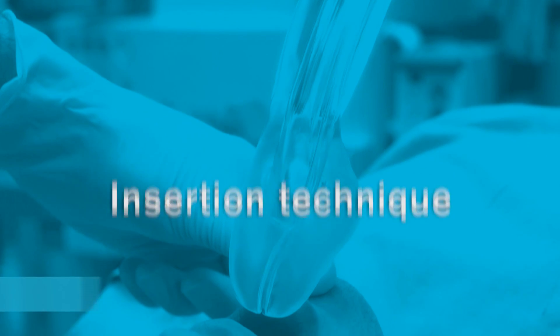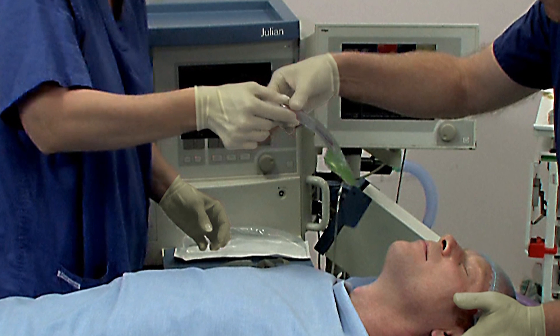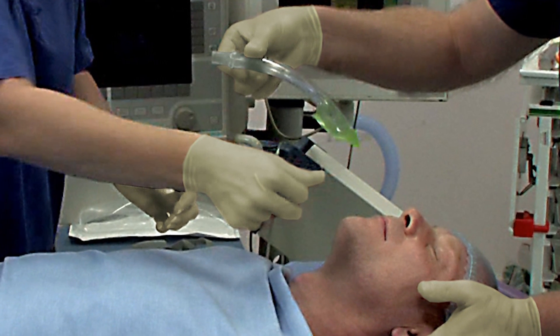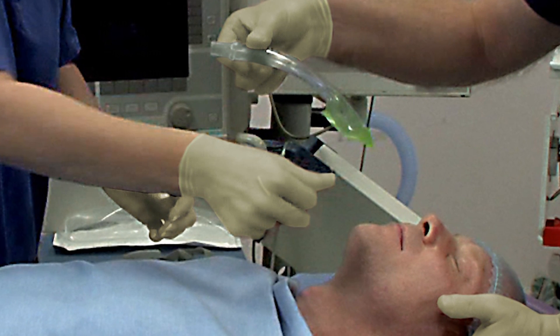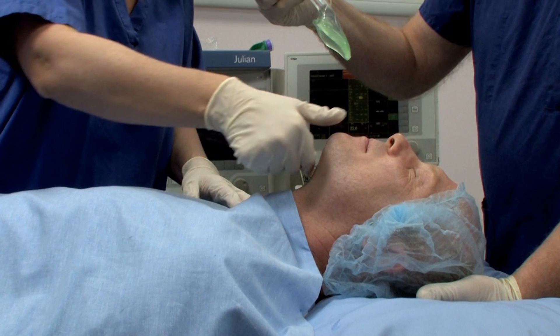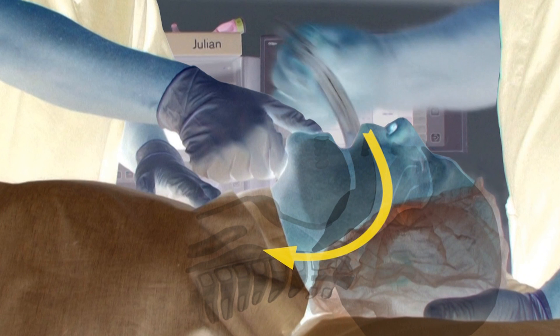Insertion technique. A proficient user can achieve insertion in less than 5 seconds. Remove the iGel from the protective cradle or cage pack. Grasp the lubricated iGel firmly along the integral bite block. Position the device so that the iGel cuff outlet is facing towards the chin of the patient. The patient should be in the sniffing the morning air position with head extended and neck flexed. The chin should be gently pressed down before proceeding to insert. Introduce the leading soft tip into the mouth of the patient in a direction towards the hard palate.